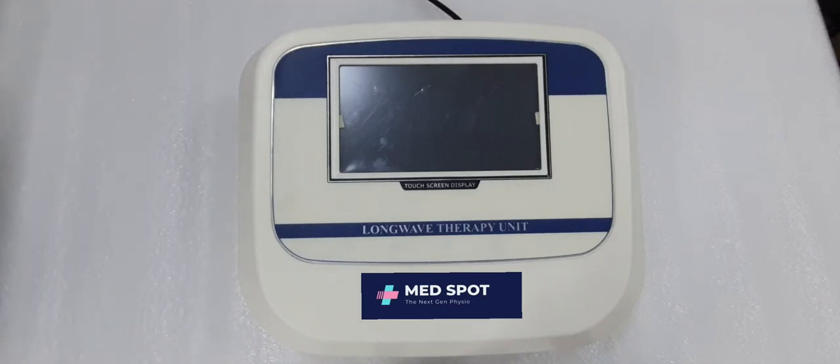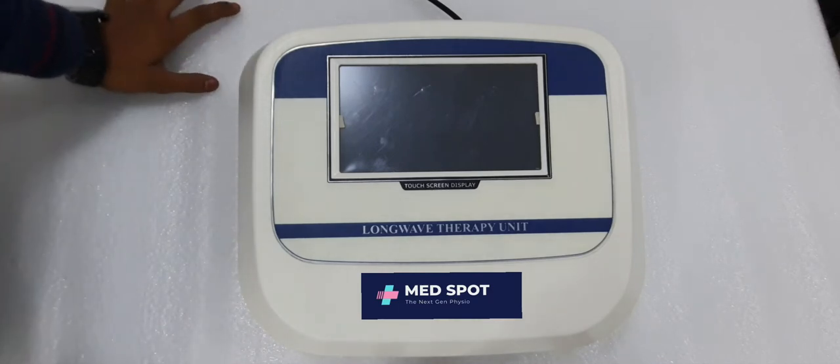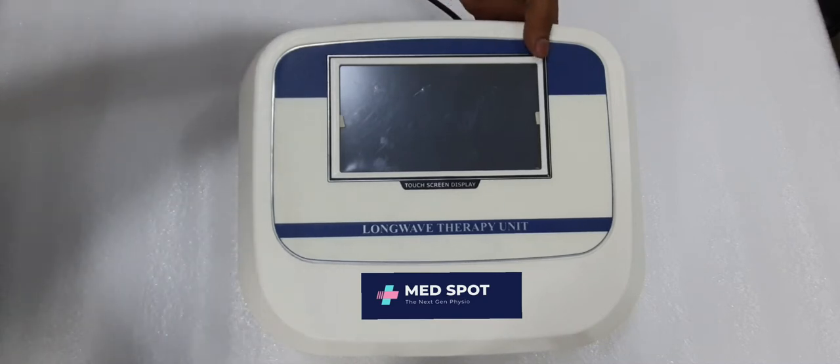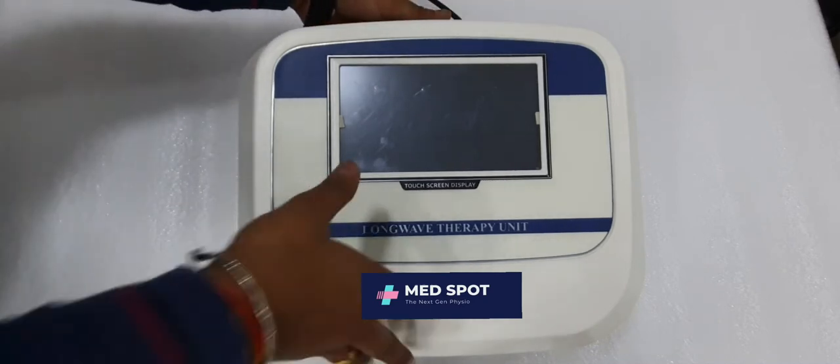Hello everyone, today we're going to show you how to operate the long wave diathermy. It's a digital model with 20 pre-loaded programs. The back side of the machine has the on/off button.